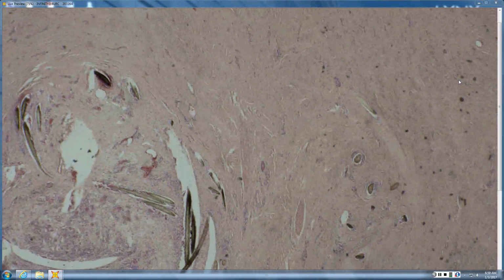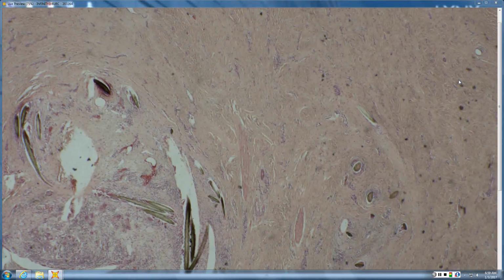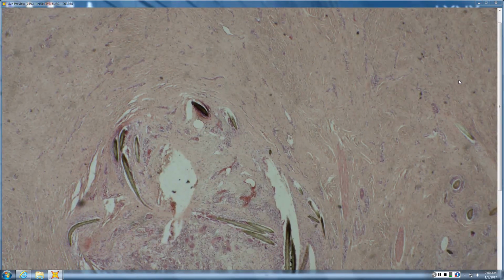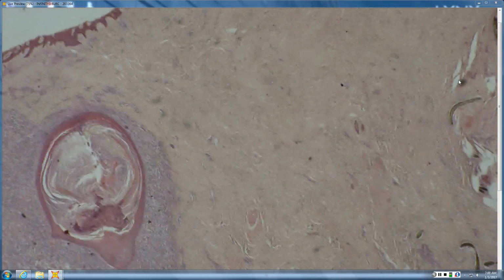and there's really not much else that looks as characteristic as this. Now there is, I will say, some overlap with folliculitis decalvans or dissecting scalp or even hidradenitis suppurativa. A lot of those things kind of look similar because you get scarring and separation, and there's often the hair shaft fragments. I mean, here is obviously like this ingrown hair that's just sort of growing in this little ball there. So you can better appreciate when you see these patients clinically what's going on beneath the skin when you look at it on derm path, which is why it's so difficult to treat.